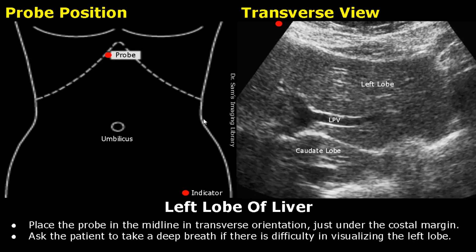The probe is placed in the midline in transverse orientation, just below the costal margin, and you will see the left lobe in transverse view. This is the left lobe and we can also see the left portal vein. It has a hyperechoic wall.